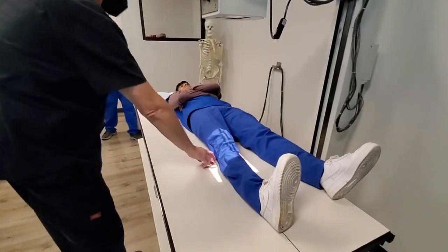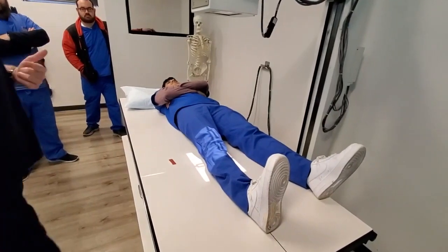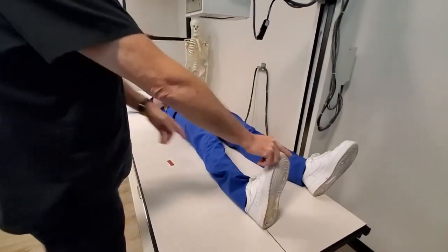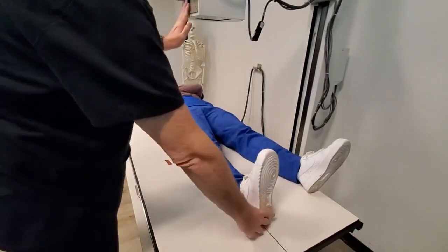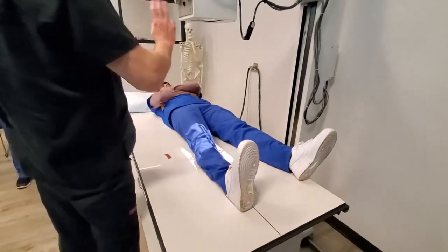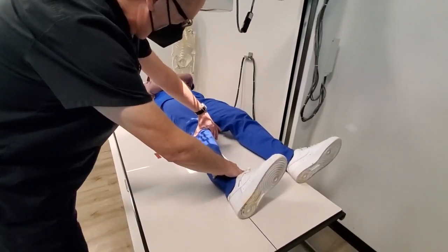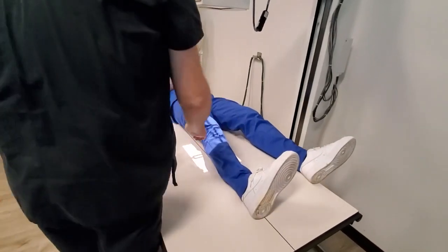What's next? We're going to do the medial oblique. How much do we want the body part rotated for an oblique? 45 degrees — the entire leg, not just the foot. So I'm going to abduct it a little bit first so that when we rotate it we're still centered. We're going to feel these epicondyles and rotate inward — 45 degrees. We want these epicondyles at a 45-degree angle to the table.